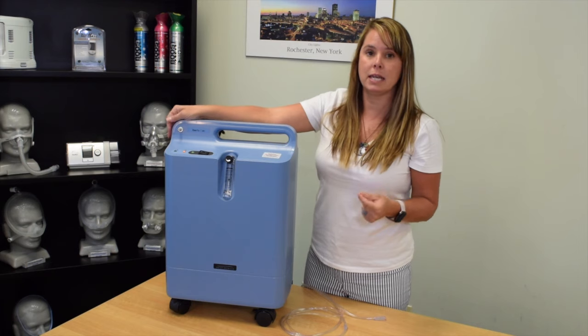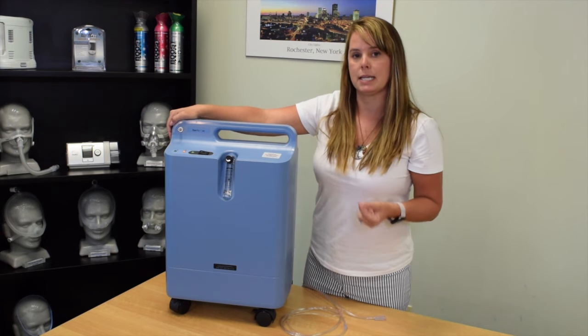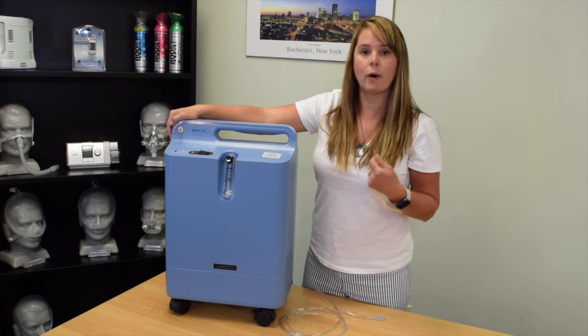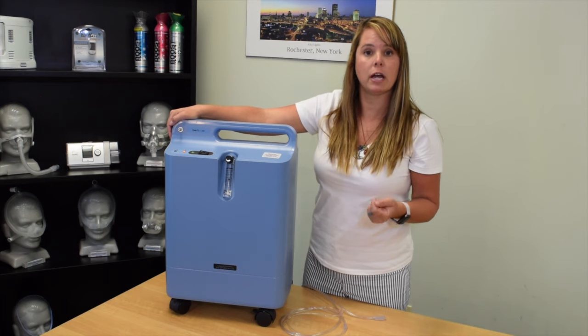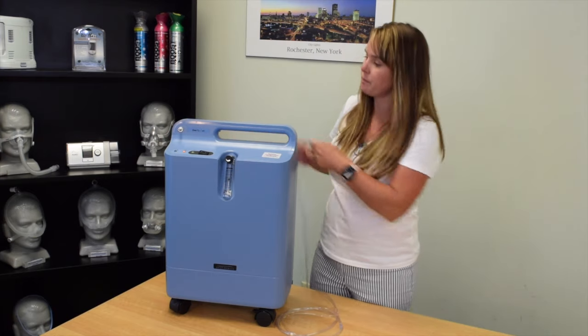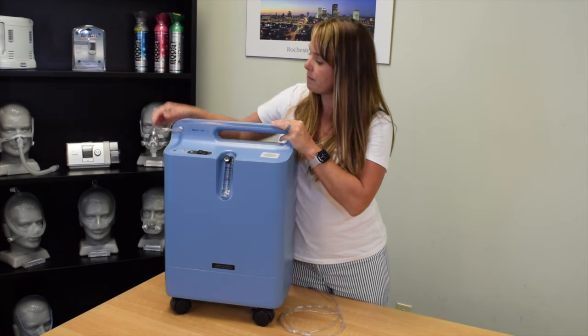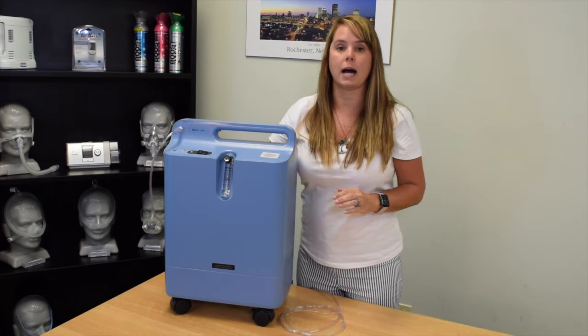If the alarm stops, then indeed there was a kink even though you couldn't maybe visibly see it. So you'd go ahead and switch out your cannula and your long tubing, put it back on here, and after a moment the alarm will stop.